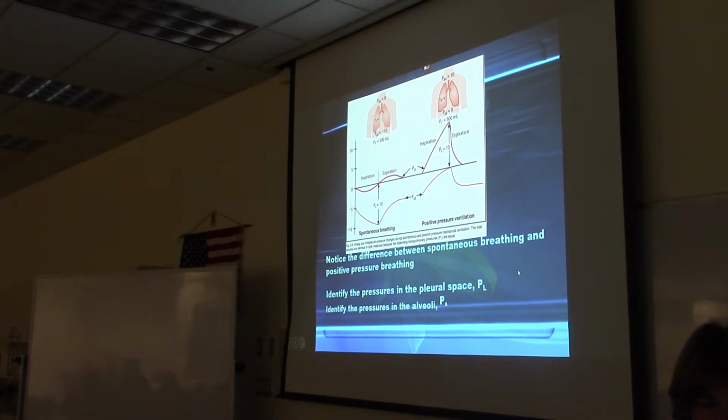Identify the pressure in the alveoli. So it's right here. It's pointing to spontaneous first. Yeah, pretty much 0. It's a little bit negative during inspiration, a little bit positive during exhalation, and then 0 at the end of exhalation.